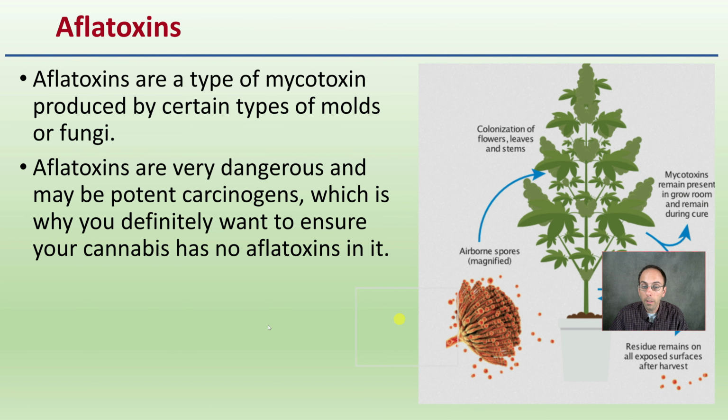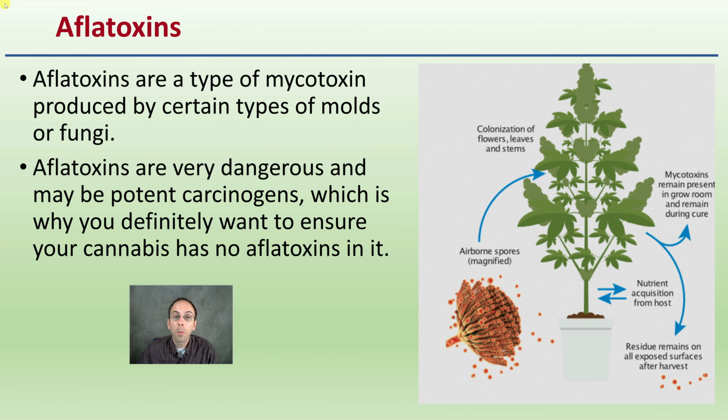Then there's aflatoxins, which are very concerning. They're a type of mycotoxin produced by certain types of molds and fungi. They're very dangerous and are potent carcinogens, which is why you want to ensure that your cannabis has no aflatoxins in it, to ensure that it's safe, at least for this particular category.